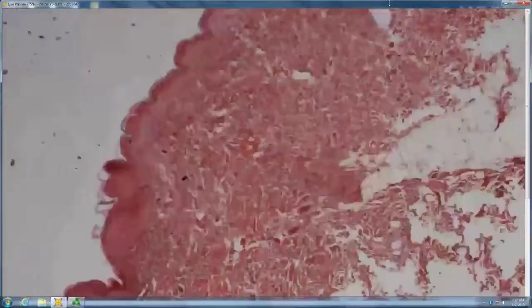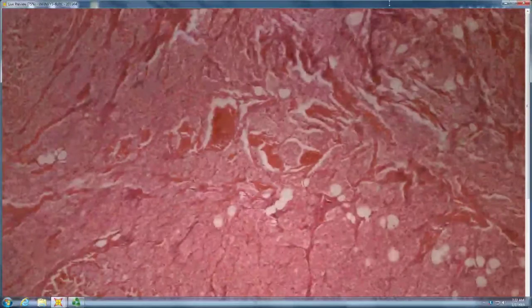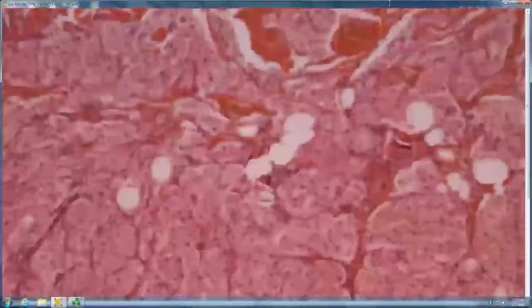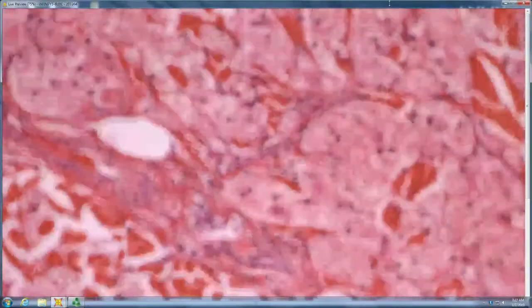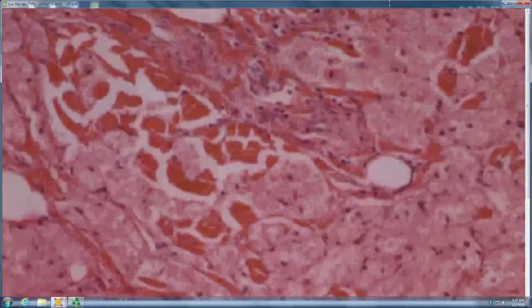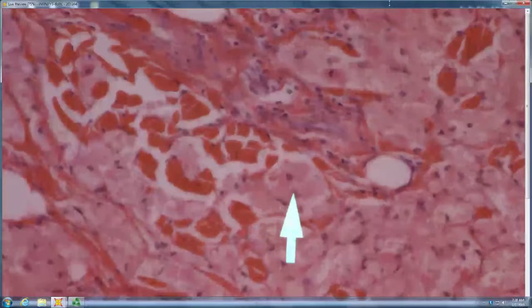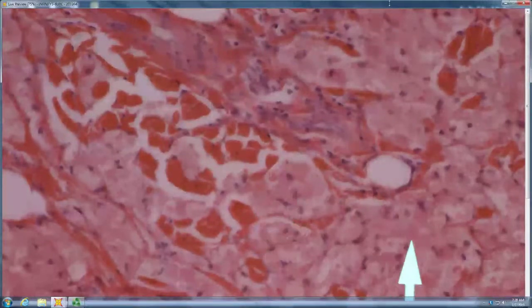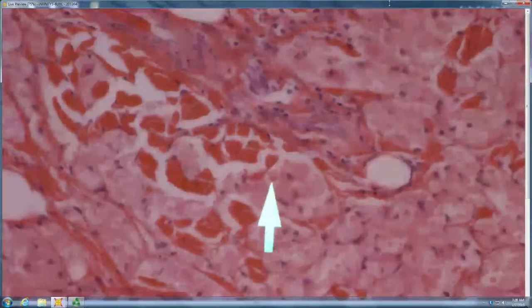So you have overlying skin. Alright, so we have very dense proliferation of cells. Kind of looks like there are pseudovascular spaces and kind of epithelioid cells. So there are certainly large cells with abundant cytoplasm. Oh, okay. And within those big cells, they have these big pink blobs. So granular cell tumor. That's a granular cell tumor. So it has granular cells and it has the giant lysosomes.